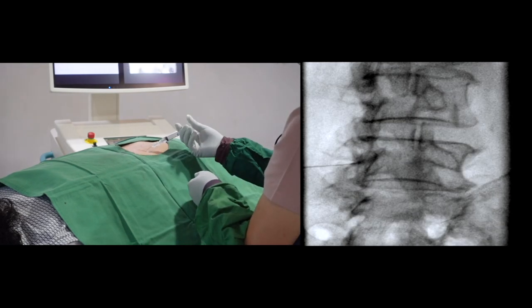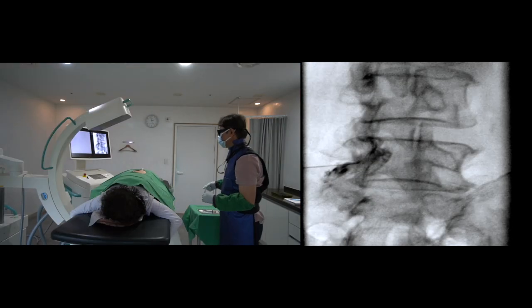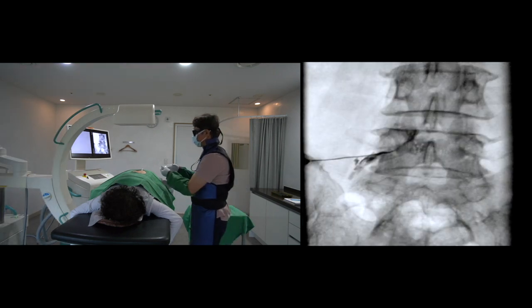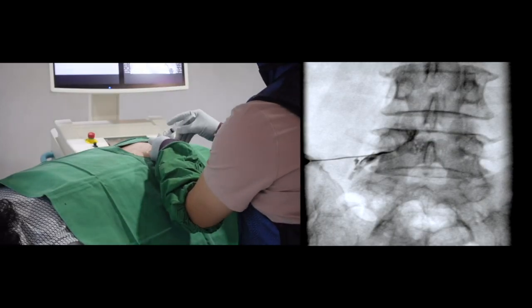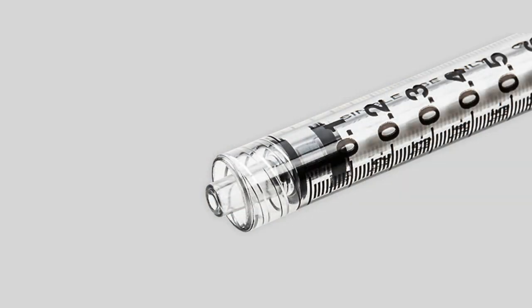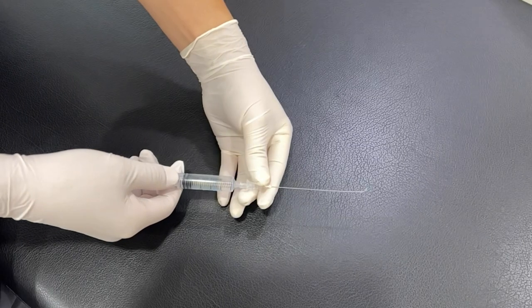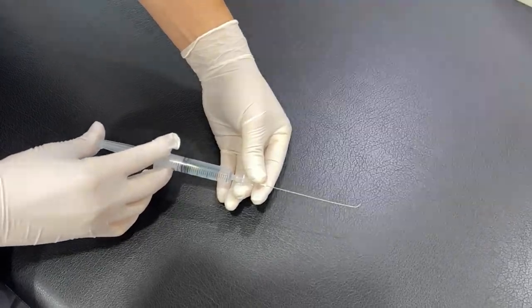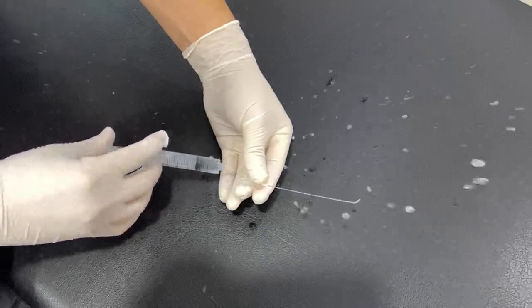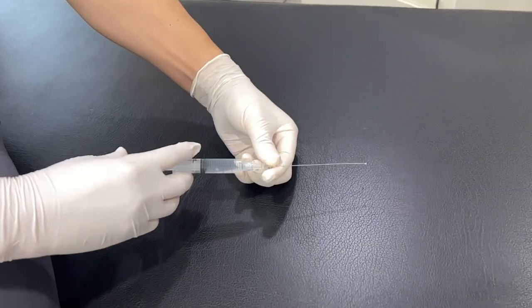Let me show you the AP view and deliver the steroids. I insist on a luer lock type syringe instead of an ordinary disposable plastic syringe. The fluid frequently leaks at the connection of the disposable syringe because of the high viscosity of contrast media and dextrose. Luer lock prevents unexpected disconnection.